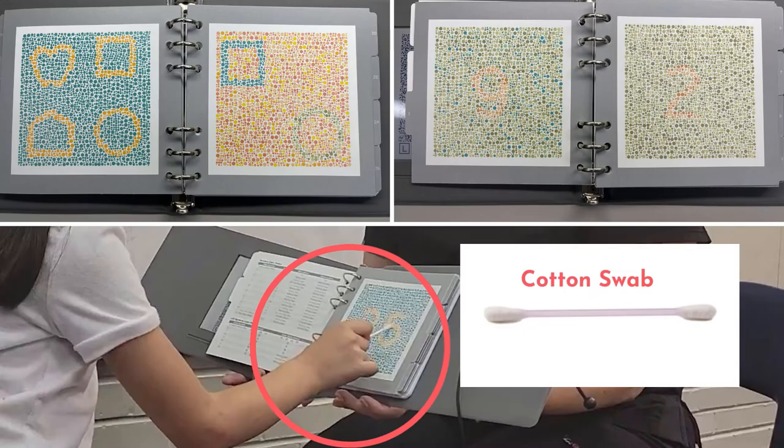Vision screening tools for color deficiency include color perception tests, which can come from a variety of manufacturers, a pointing device such as cotton swabs or similar, and a brush for cleaning the tools as needed.